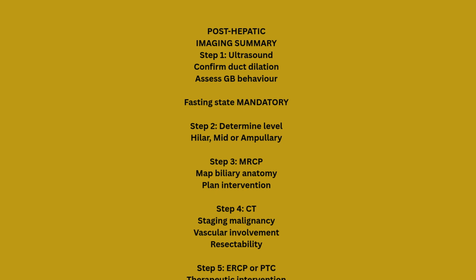Post-hepatic imaging workflow. Ultrasound first to confirm dilatation and assess gallbladder behavior. Fasting state mandatory. Determine the level of obstruction. Then MRCP to map biliary anatomy and plan intervention. CT for staging malignancy and assessing vascular involvement and resectability. Then ERCP or PTC for therapeutic intervention.